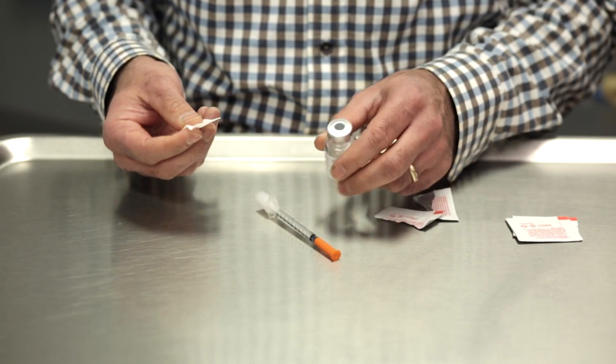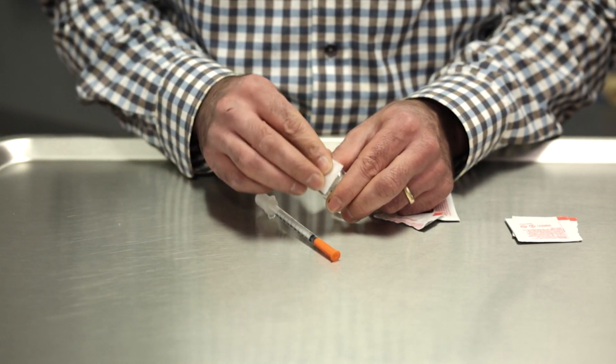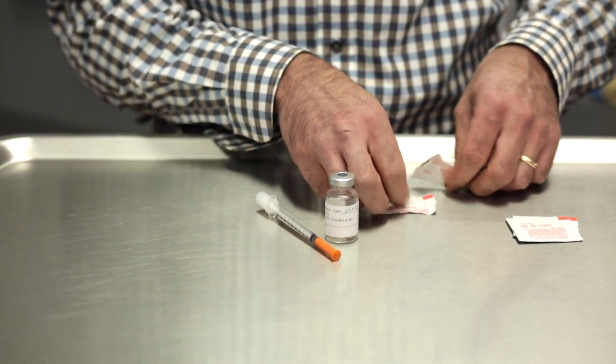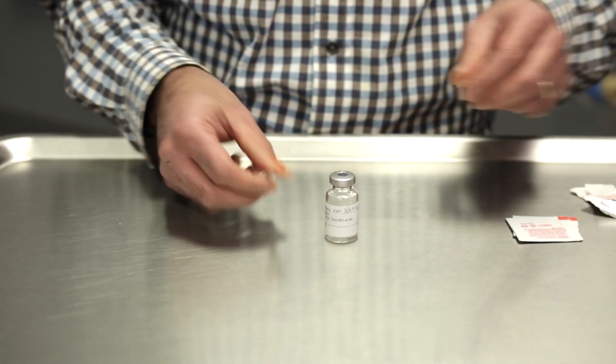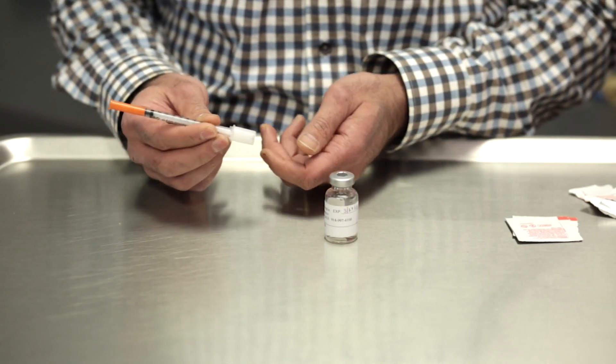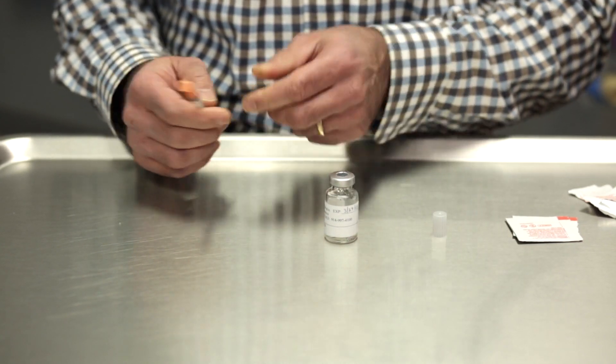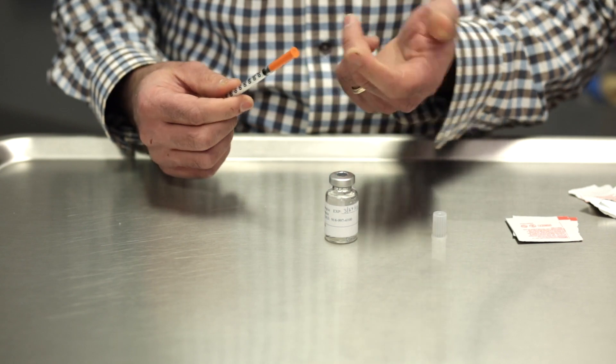Remove the alcohol swab and cleanse the rubber stopper with alcohol to clean off any bacteria. Then grab your syringe, which has two removable pieces. The bottom piece comes off, which reveals the stopper, and the orange cap on top reveals the needle.